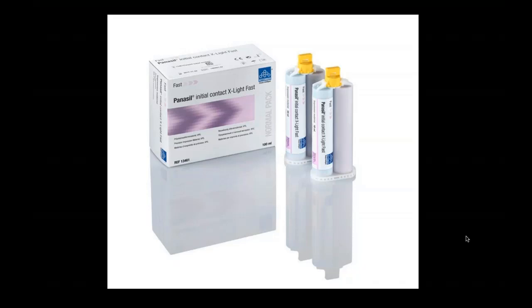Can't Silginat be used as a tray type material and take a wash in it? I have never used Silginat as a tray material. I prefer to use the putty and then a wash. It is a polyvinyl. I've actually never tried that.